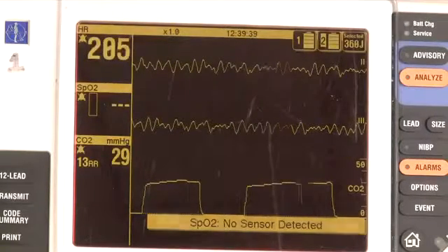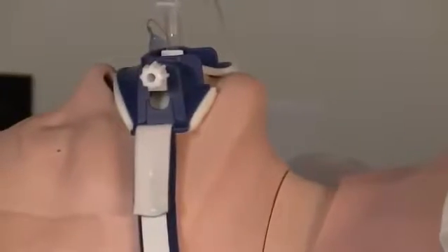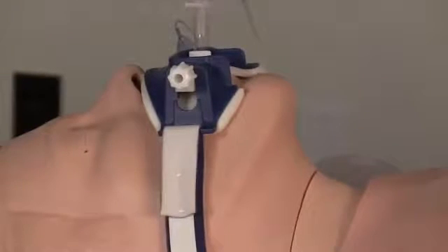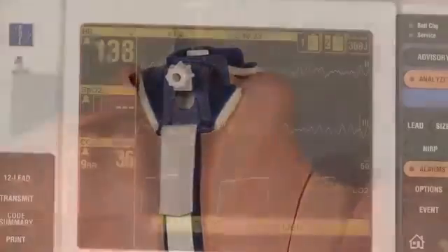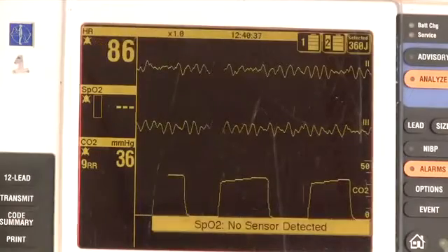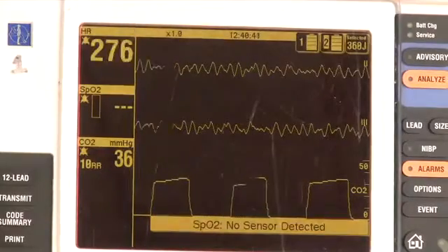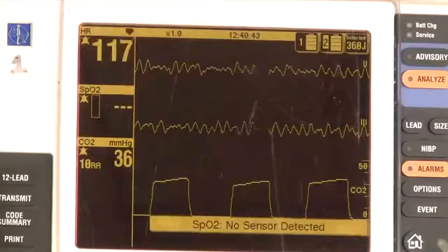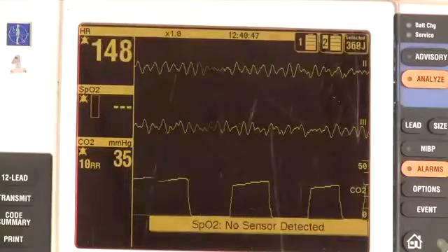Capnography sensors can be placed on endotracheal tubes, oxygen masks, or nasal cannulas. Obviously, in the case of cardiac arrest, we prefer to measure CO2 off an endotracheal tube. In addition, waveform capnography is required to validate placement of the endotracheal tube at intubation or any time when the patient is moved. It's our only tool that tells us definitively that the endotracheal tube is where it belongs and has stayed there.